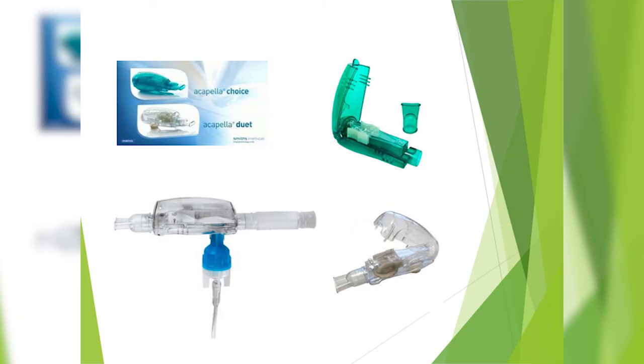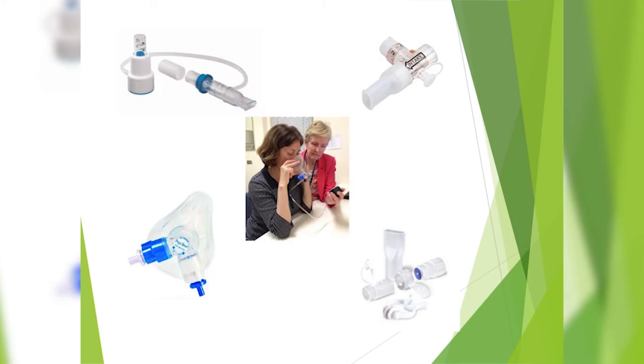Another good option is the acapella, although there are difficulties with it because it's more difficult to clean — it has a lot more little places for germs to hide. There are two acapella devices I would recommend: the Acapella Duet and the Acapella Choice, because those can actually come apart and be cleaned easily. The Acapella Duet can also be used with your nebulizer hooked up to it, so that's very handy.